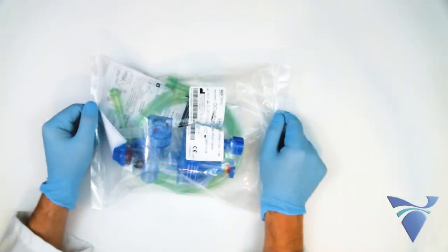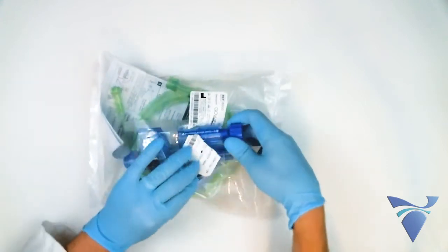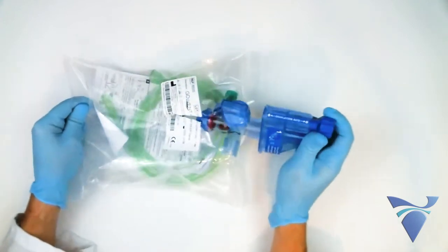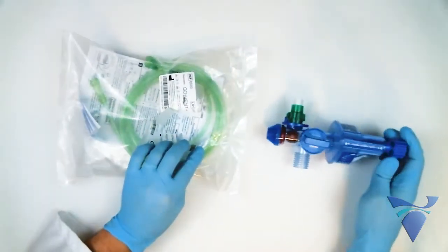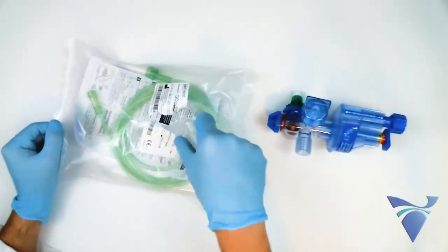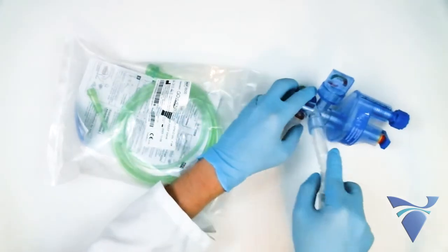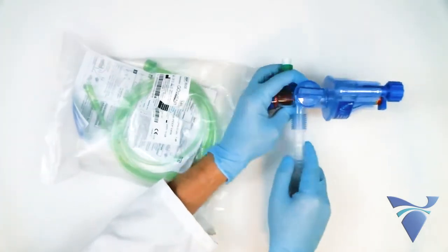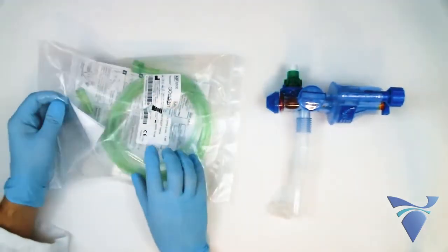The GoToVent comes packaged with everything you need to connect between the patient and your oxygen source. Included is the GoToVent itself, a flex hose for connecting the GoToVent to the patient's mask or endotracheal tube, and oxygen tubing.